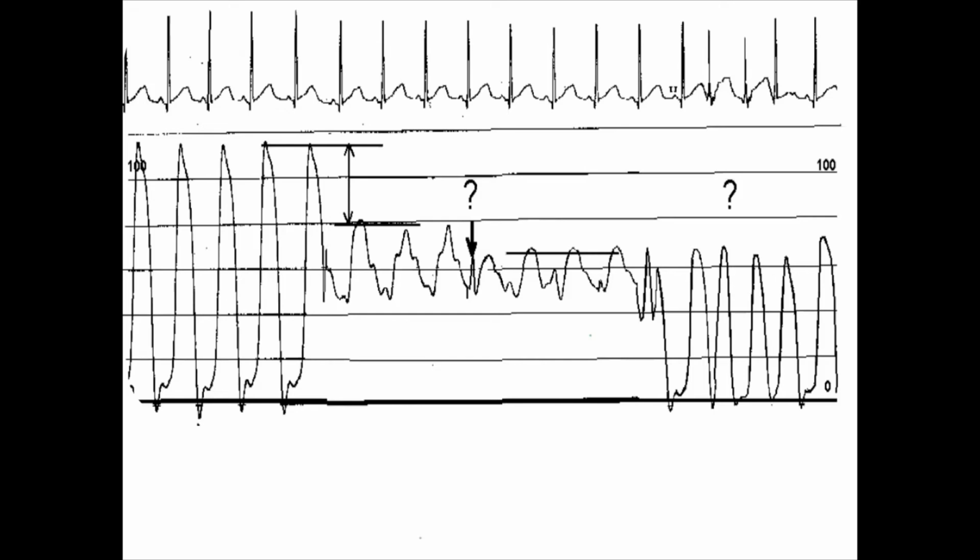This is a pullback catheter from the LV to the LVOT. From LV, you mean on my left hand? Yes. Okay, this is LV, because the figure looks like LV. Tracing of the aorta. Hemodynamic tracing.